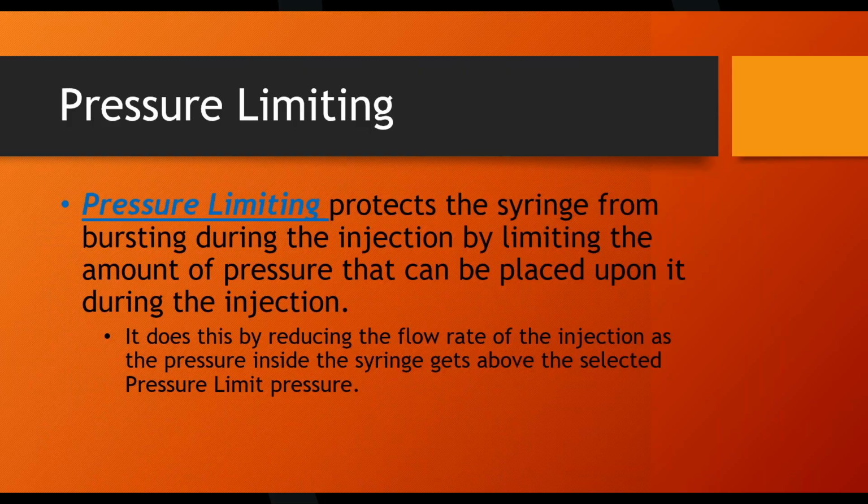And there's an audible beep, and everybody in the room knows that it's happened, but typically, pressure limits are very, very rare in the real world because everybody knows you can shoot these shots to produce these pressures. And typically, if you're getting a pressure limit alarm, it's because the system is misreading the pressure. It'll say, yeah, I'm hitting 300 PSI when it's not actually hitting 300 PSI.